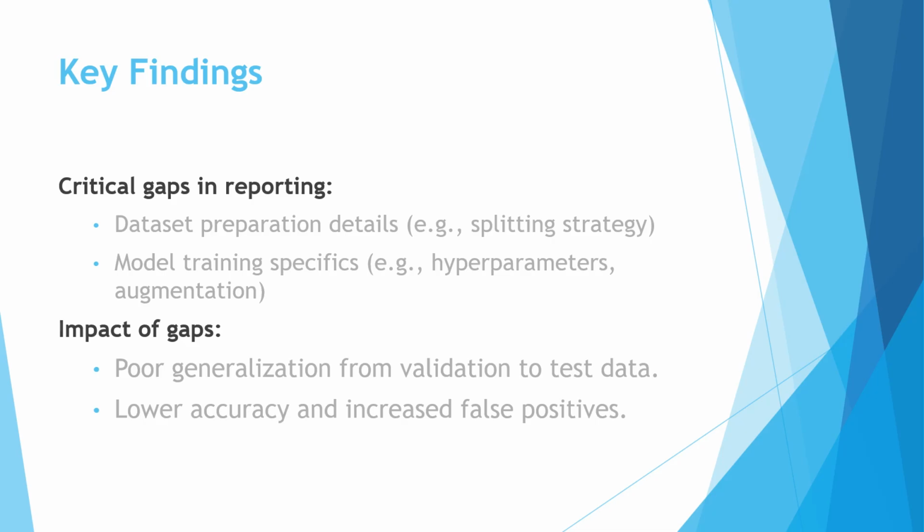For example, the hyperparameters that they have used for training the model, and also if some augmentation techniques were used to increase the number of training data.